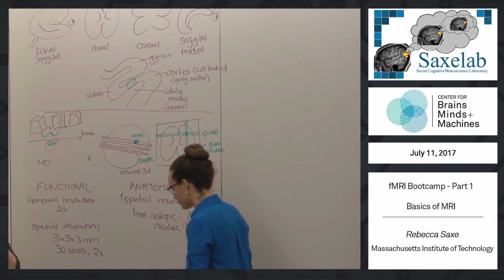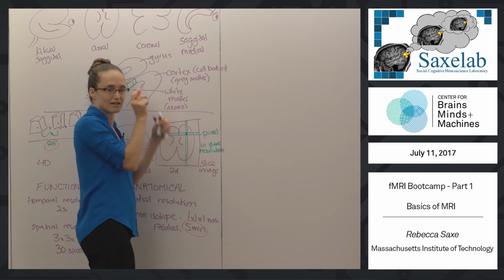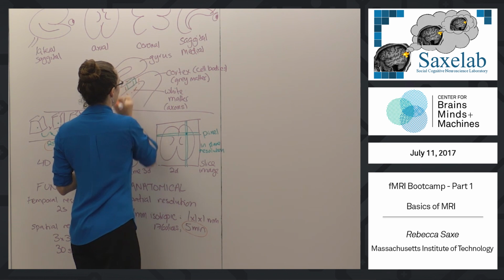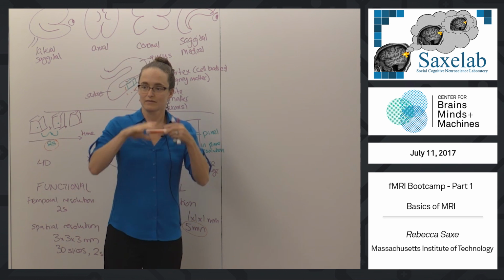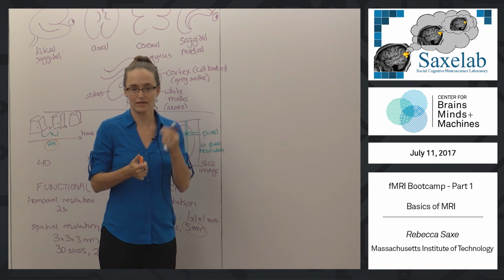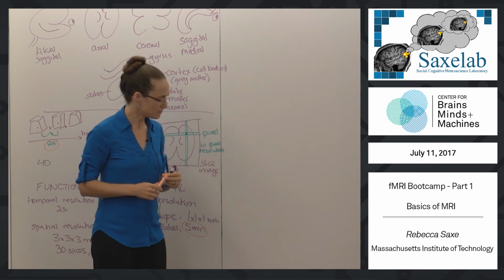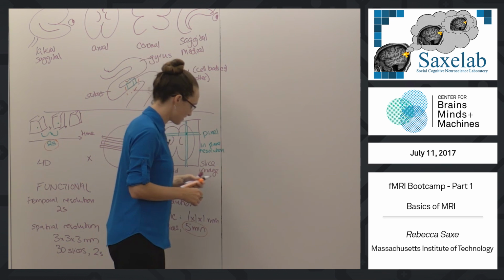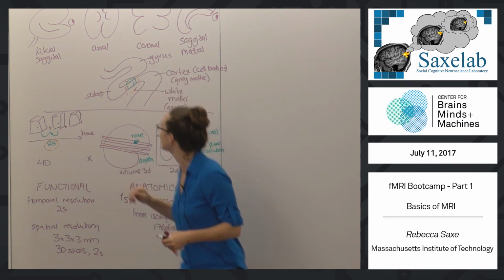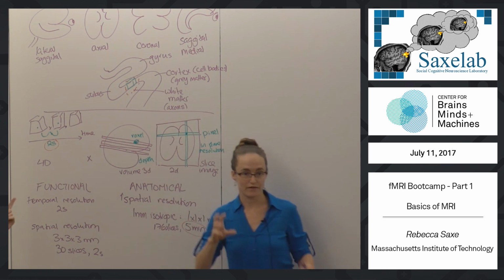It also almost always isn't just inside the cortical sheet, but often extends out beyond it. Sometimes bleeding across the walls of sulci, sometimes going into the white matter. These voxels are big compared to the structures that we're trying to study. I think I drew the anatomical voxel wrong. I think the cortical sheet is more than 1 millimeter. I've set this factor wrong by something. Okay, but in any case, this is still definitely a problem that the voxels are so big.